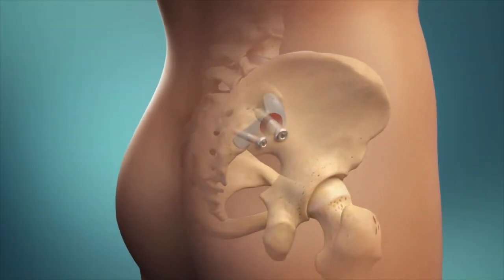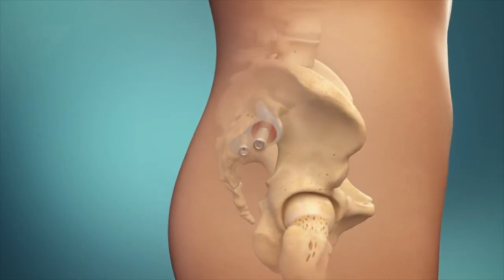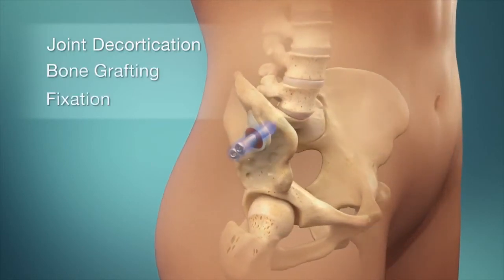The Symmetry sacroiliac joint fusion system is built on proven orthopedic fusion principles: joint decortication, bone grafting, and fixation with threaded implants.